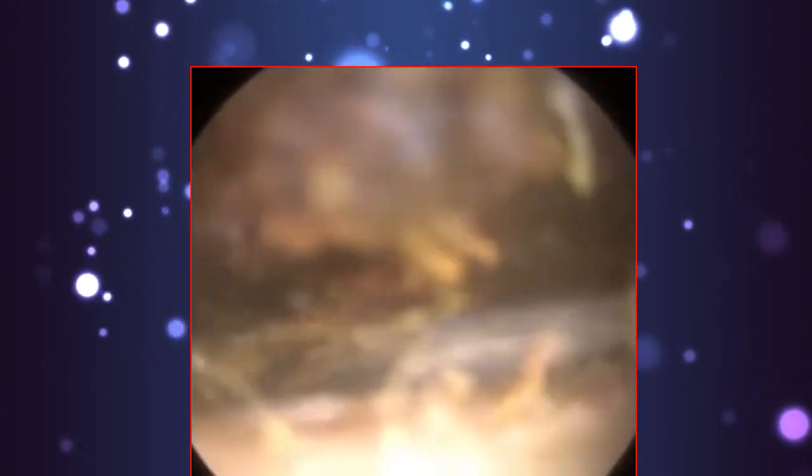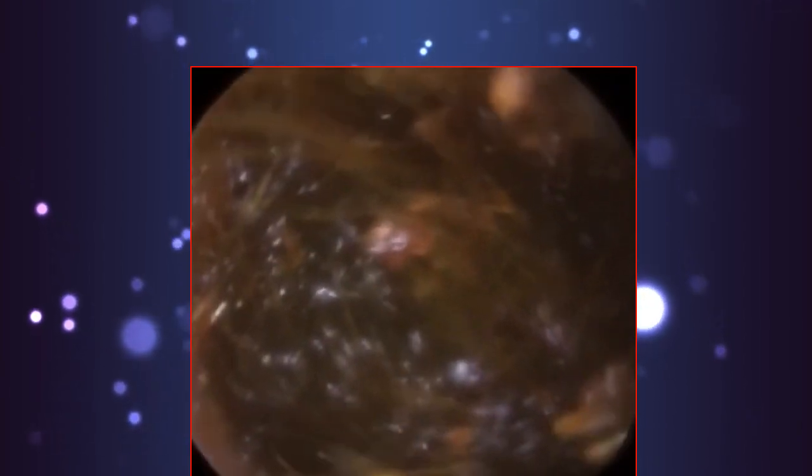I could feel this part of the wax I was extracting was going to come loose with the main body of the wax a bit deeper in. And when the patient attended, he was virtually unable to hear me. It was one of the most severe impactions, I would say, I've seen in a long, long time. So this last plug, which is deep in the ear now, is trapped in a narrowing called the isthmus. So the isthmus is about 0.5 centimetre away from the eardrum, and we all have a natural narrowing, and this patient's managed to really impact it and embed it in this narrowing.